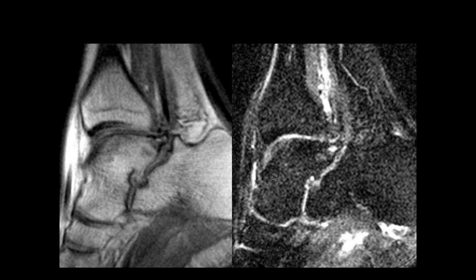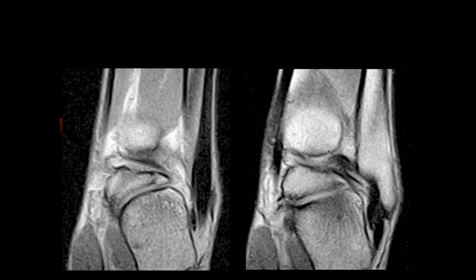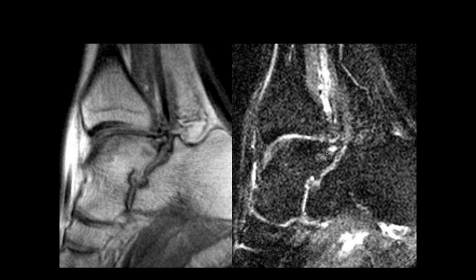Here we can also see a steta process with osteophytosis between the posterior talus and the calcaneus — compatible with posterior impingement with quite abnormal articulation. This is someone in a small extremity scanner where the foot has to be plantar-flexed, showing the position where impingement occurs, with bone edema here.